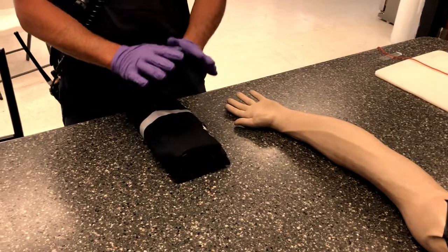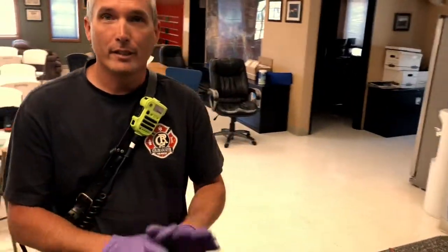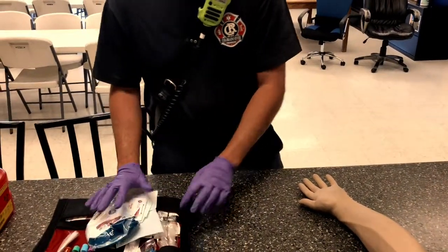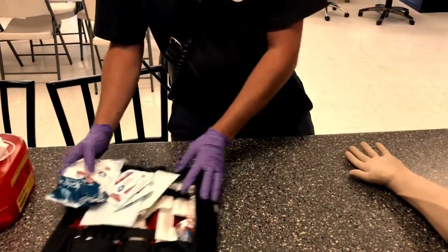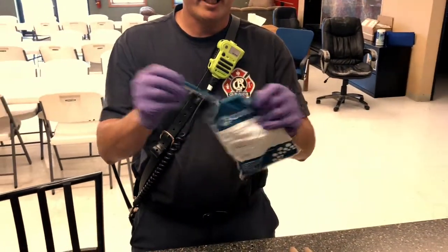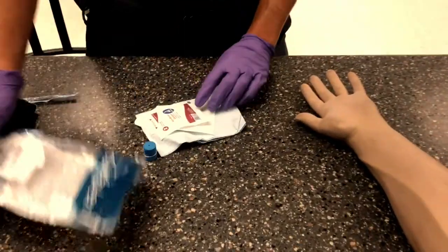So the most important part of an IV is being ready to start that IV, and that is your setup of your skill. Everything is contained efficiently in our IV rolls. So before you even worry about the patient, you know you're going to start an IV on this patient, we want to get everything set up for that patient. So we have our IV start kits. We want to open those using a perforated bag, fix everything neat, get our area, roll it out.